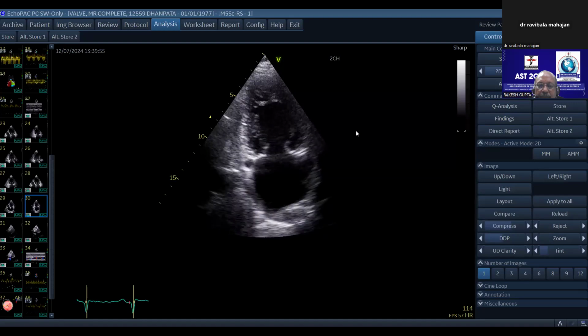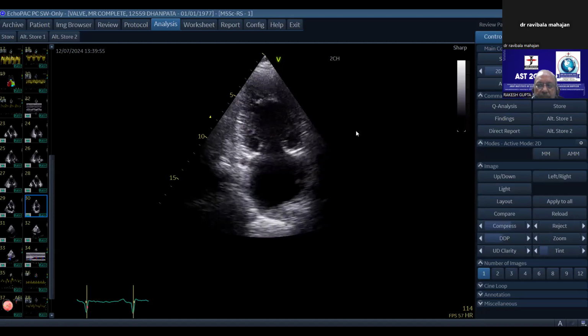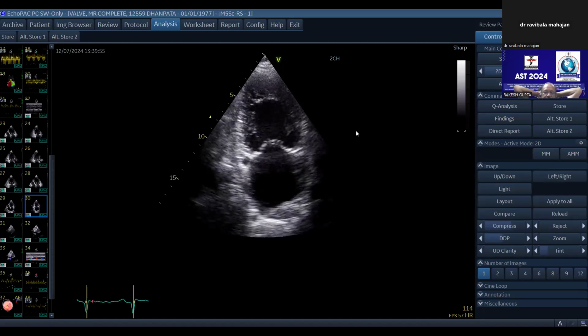Sir, in the last MR lecture, madam mentioned that for the pulse wave A and E ratio, if the A is more than E, then it cannot be severe MR. What is the point she mentioned? If the A is more than E, then it cannot be severe MR. How is that point valuable?